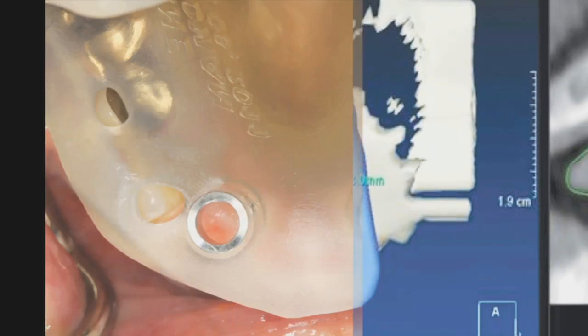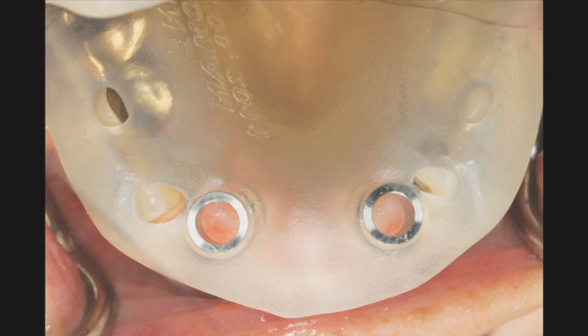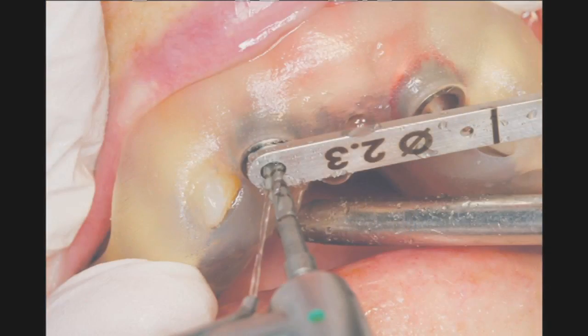So at this point, we're demonstrating the fact that the dental laboratory, Glidewell Lab, created a surgical guide with sleeves to accommodate various keys used for each diameter of drill. Now remember, we virtually placed the implant, so we know the type of implant, the size, shape of implant that we're going to place, as well as the brand that we're going to place. And so this surgical guide will allow us to predictably place the implant in ideal position. This will be a flapless procedure.